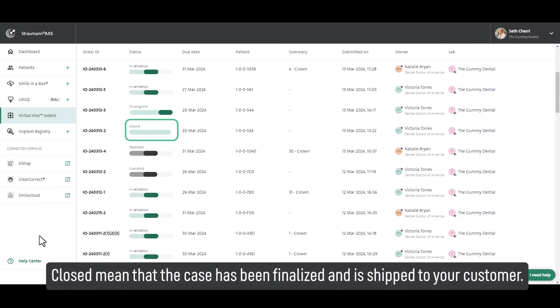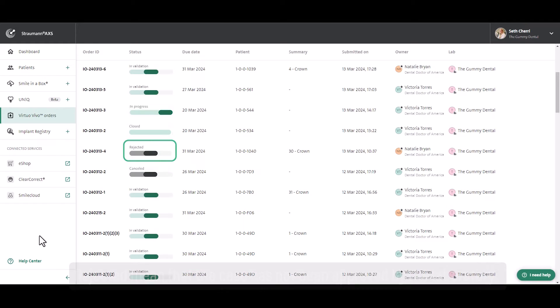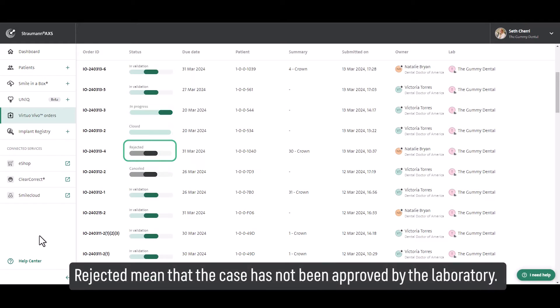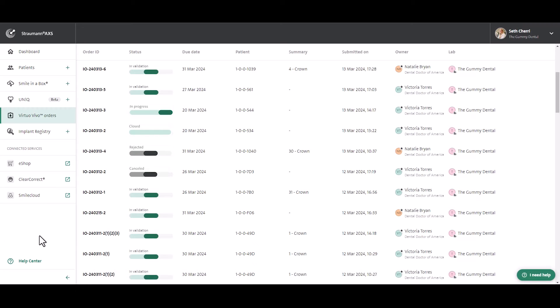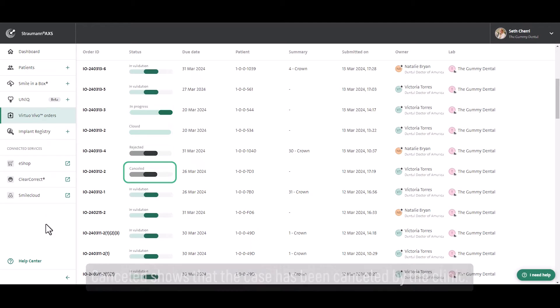Closed means that the case has been finalized and is shipped to your customer. Rejected means that the case has not been approved by the laboratory. Cancelled shows that the case has been cancelled by the clinic.